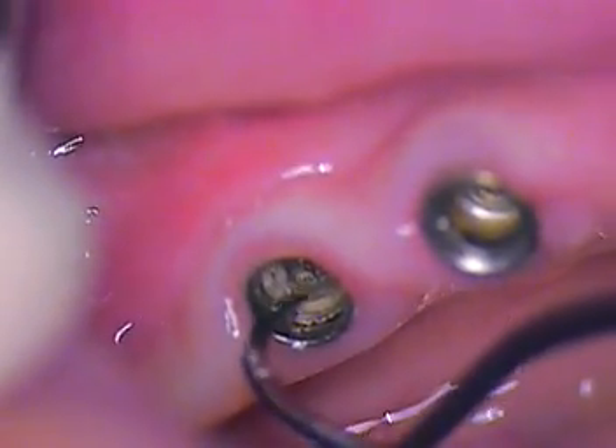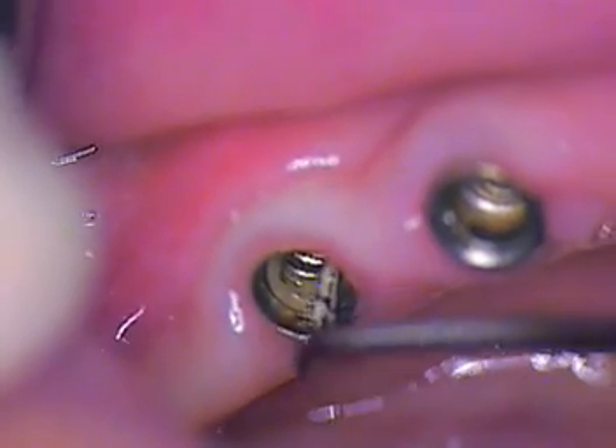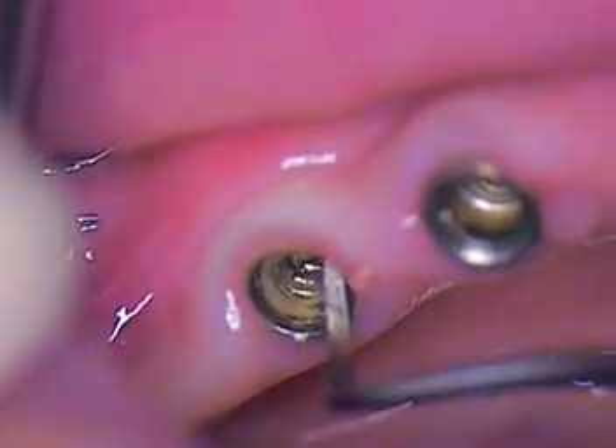As we do that, it's getting looser and looser, so that's the good news. The second step of this removal is just to check the threads. The threads aren't going to be covered with anything, like the one on the right, so they're going to be very clean and we can check them. I do know that there's no perforation in the metal, so that's the good news.